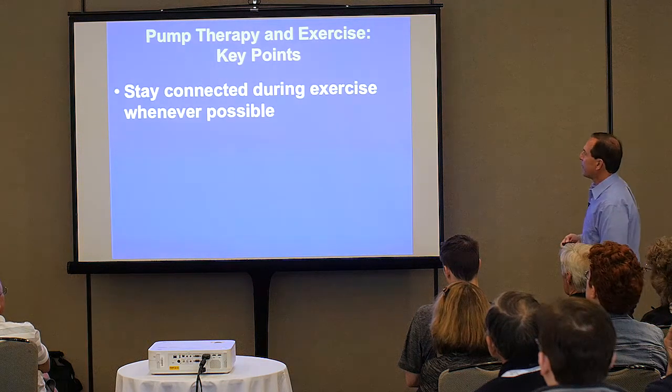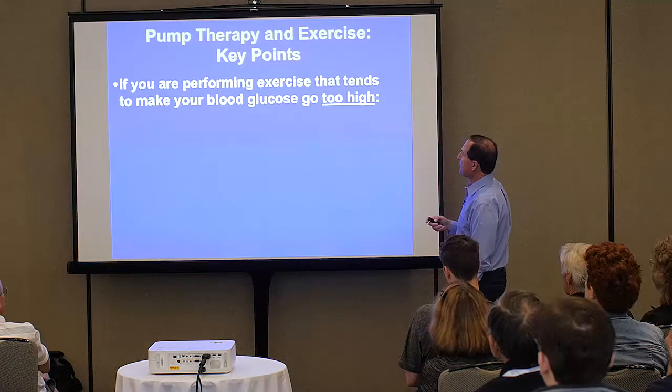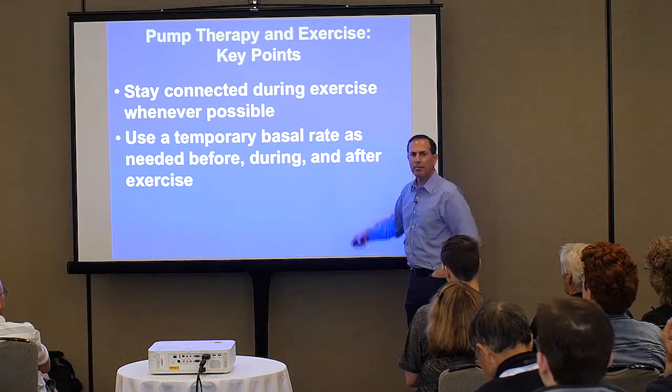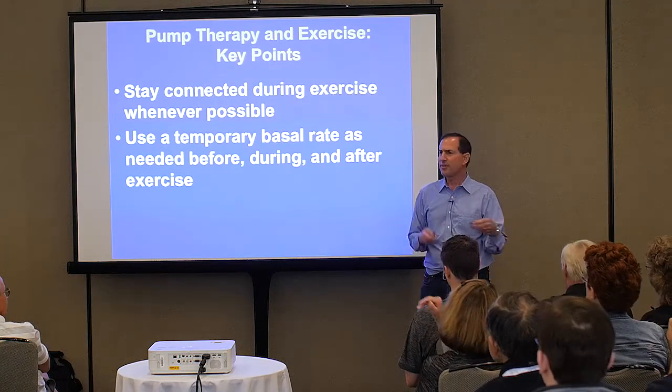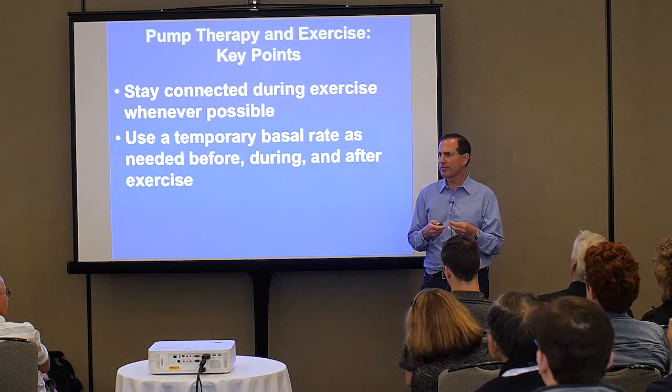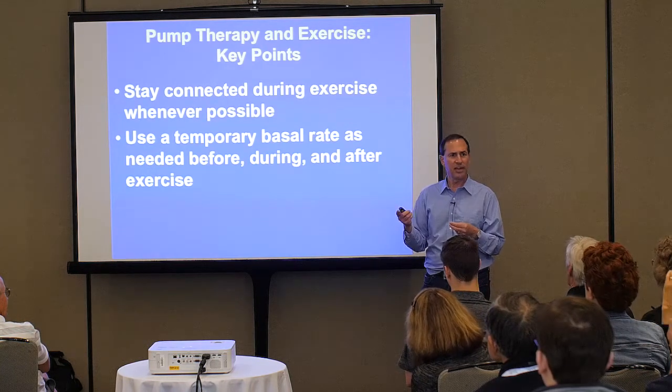Some key points that he came up with, talking about temp. How many of you use a temp basal setting? Okay, most of you do. Do you feel comfortable that you know how to do it, or is it sort of winging it? Yeah, you do? Okay.